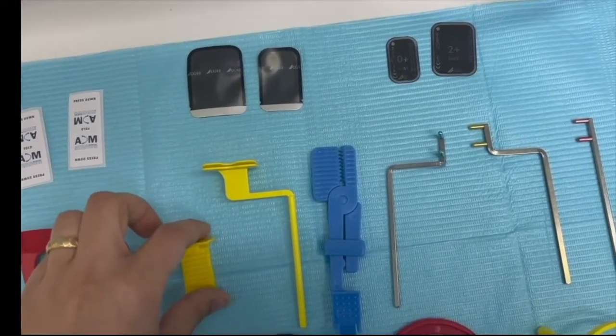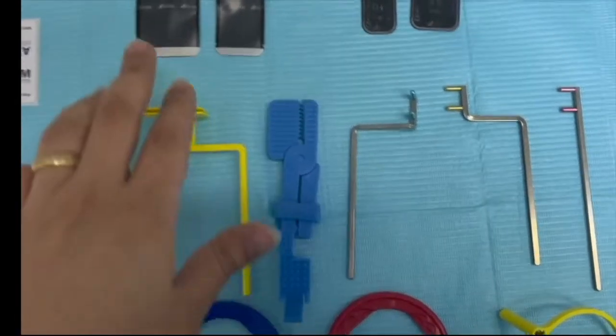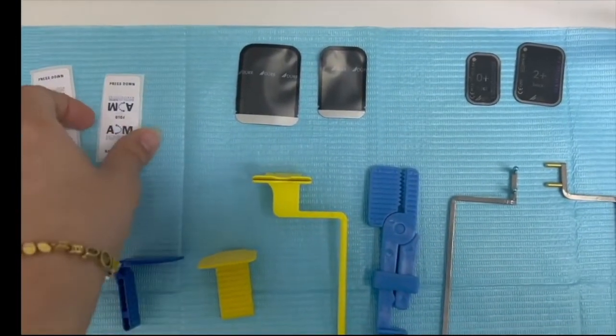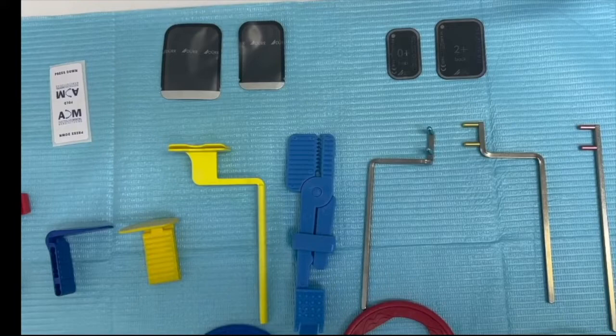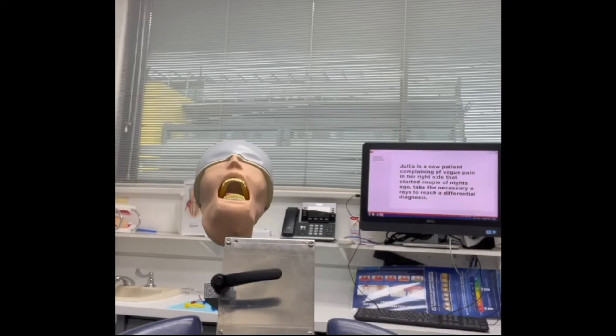You will also find the Snap-a-Ray film holder, which looks like scissors — the blue one. You will find hygienic bags in two sizes, along with bite tabs and phosphor plates in different sizes. Size 0 and size 2 — size 2 is for posterior PA and bite wings. There is also another size for occlusal film, and for occlusal you don't need film holders or arms.